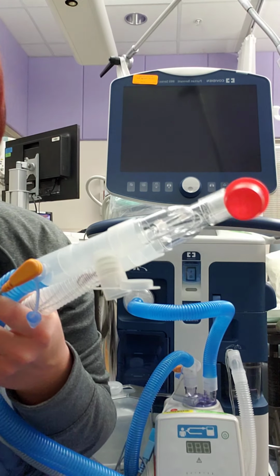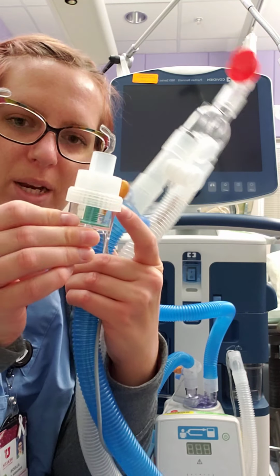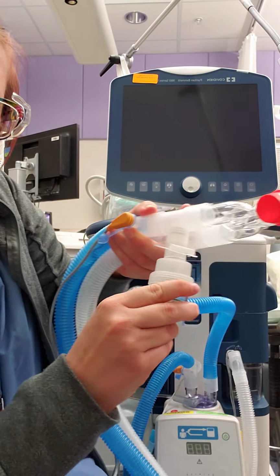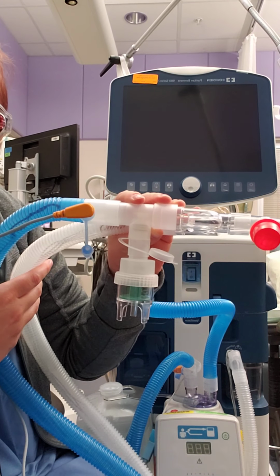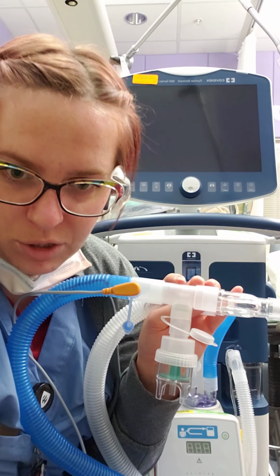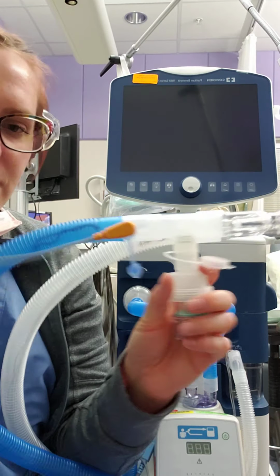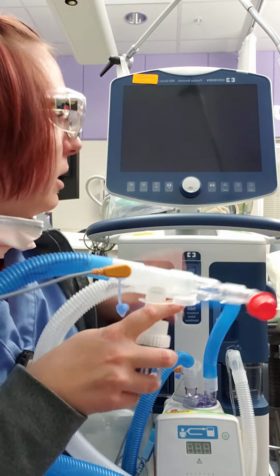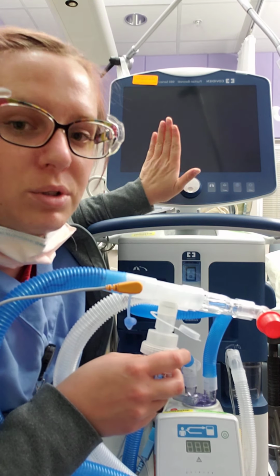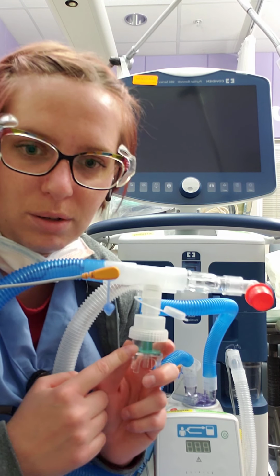So then we take our SVN, instill the medication into the cup, insert it into the spring T valve, and then start our nebulization at 7 liters. You do not want to do a vent check while running a spring T adapter to your patient, because it's going to change the volumes and the flows being administered to your patient. So do not do your vent check while you're running. Do it before or after you're done administering the medication.